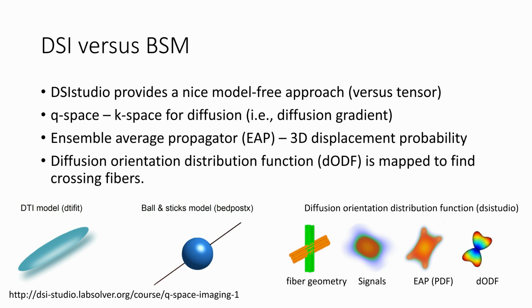So just to create a counterpoint, I basically talked about FSL this whole time, but that's not the only game in town. A few notable packages are Noddy, MRtrix, and DSI Studio. I'm going to focus on DSI Studio because I enjoy it. It's fun. If you want to play with it, it's a bit of a beast to install, but once you've got it installed, it's actually quite nice to work with. Again, to start working with it, I would take everything through topup and eddy so you have the cleanest data possible.